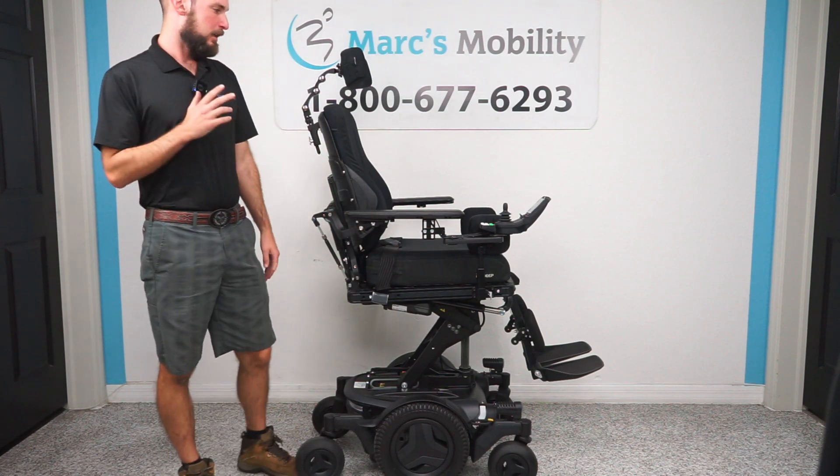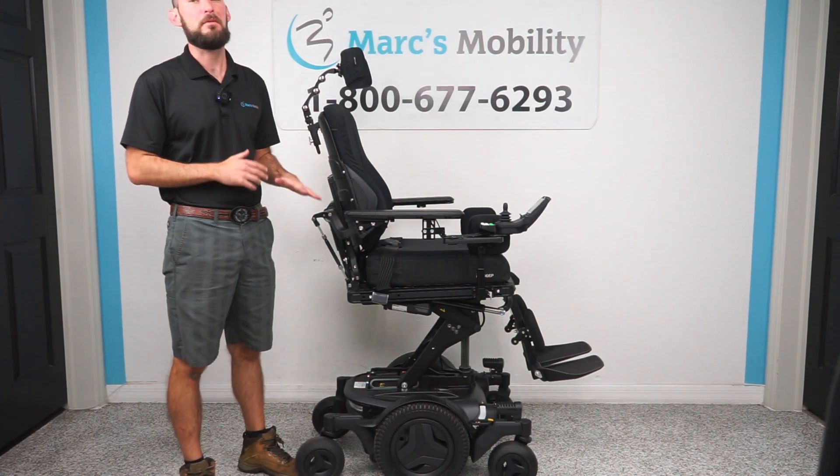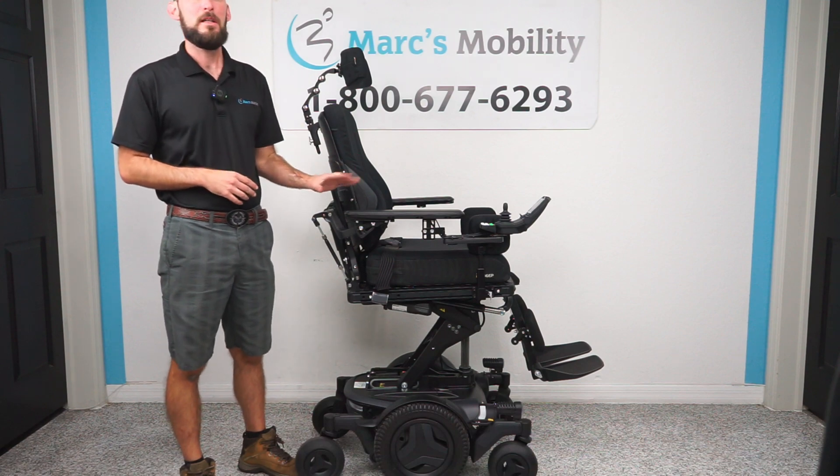I'm Scott with Mark's Mobility. Today we're going over how to program a memory function on the newer electronic versions of the Permobil, so stay tuned.